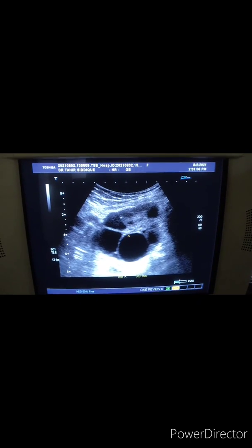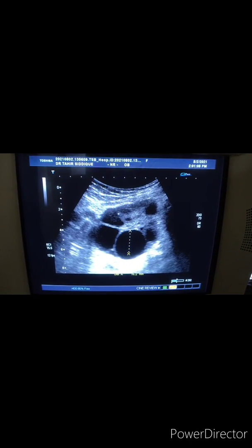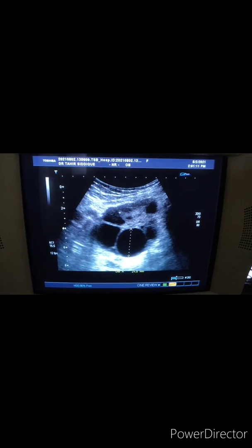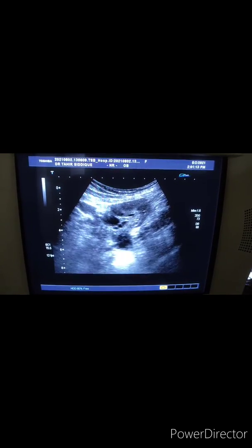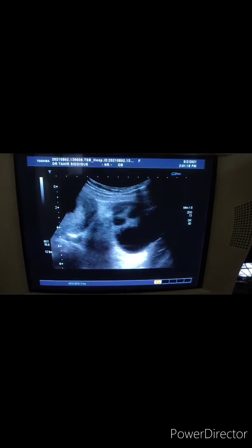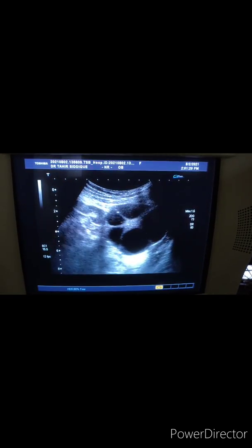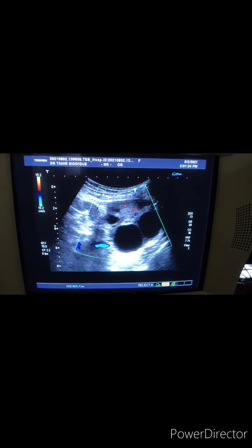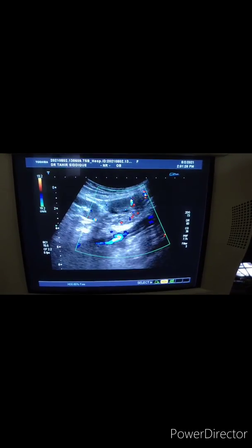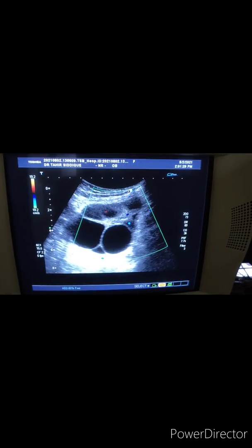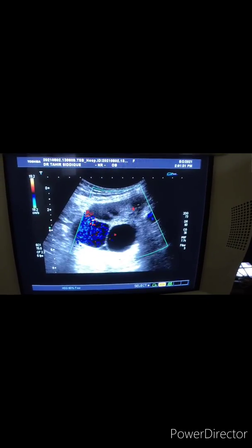The largest of these measures approximately 3 centimeters, and there are multiple non-communicating cysts. Little vascularity is seen within the stroma.